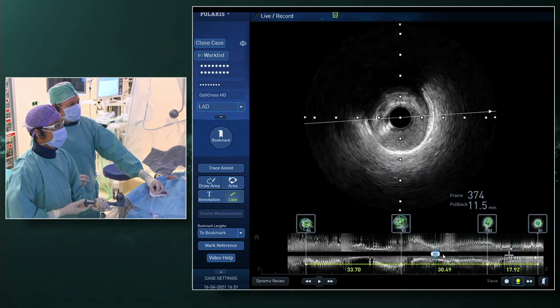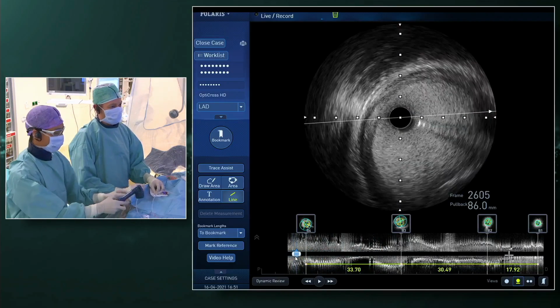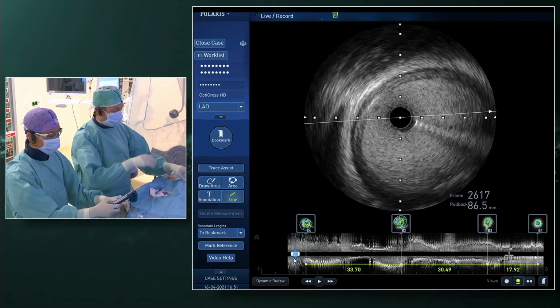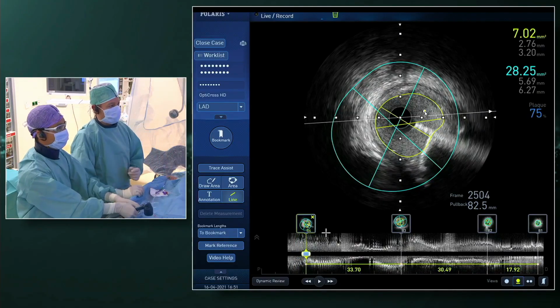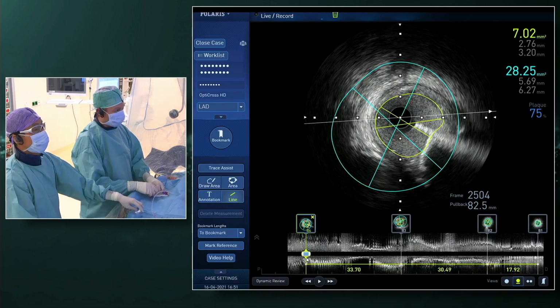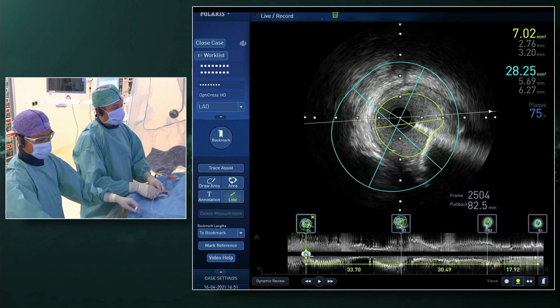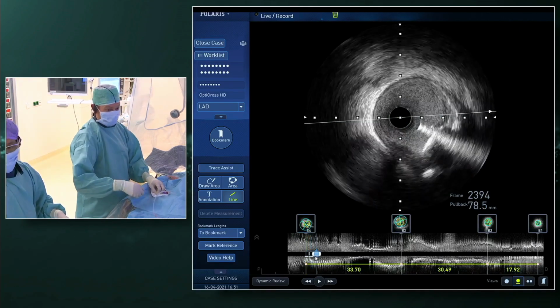With that, we hope to be able to avoid left main or complex bifurcation stenting. So we left open the ostium of the circ, which will then allow us to easily wire that and see if we can optimize this proximal part of the circumflex a little bit. So the patient is doing fine.